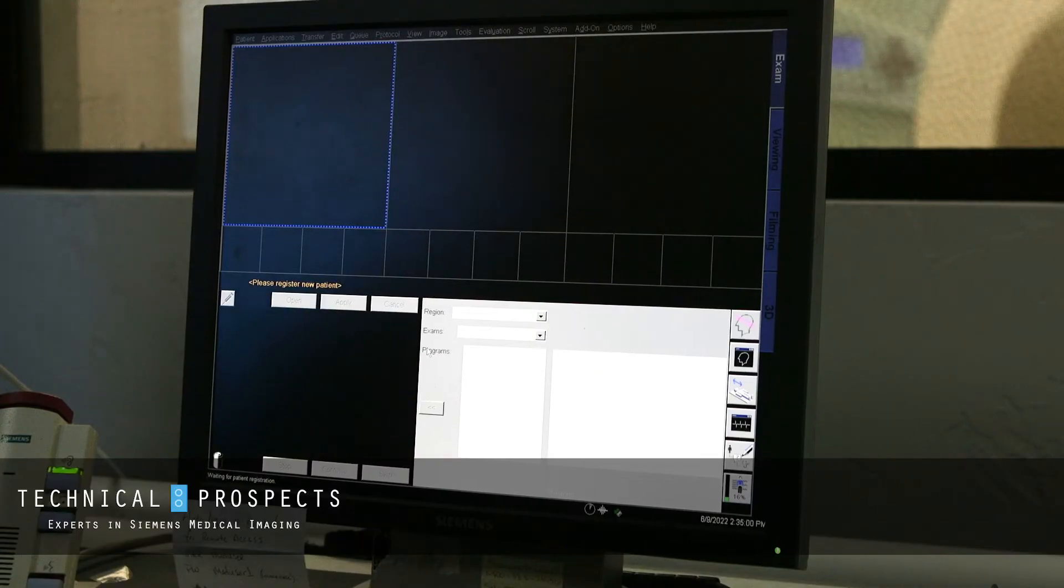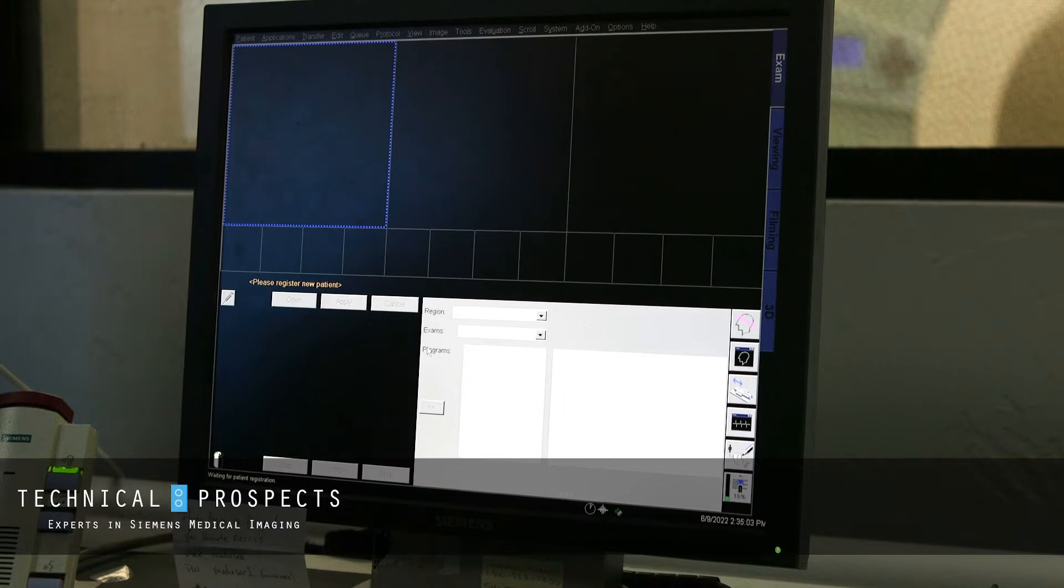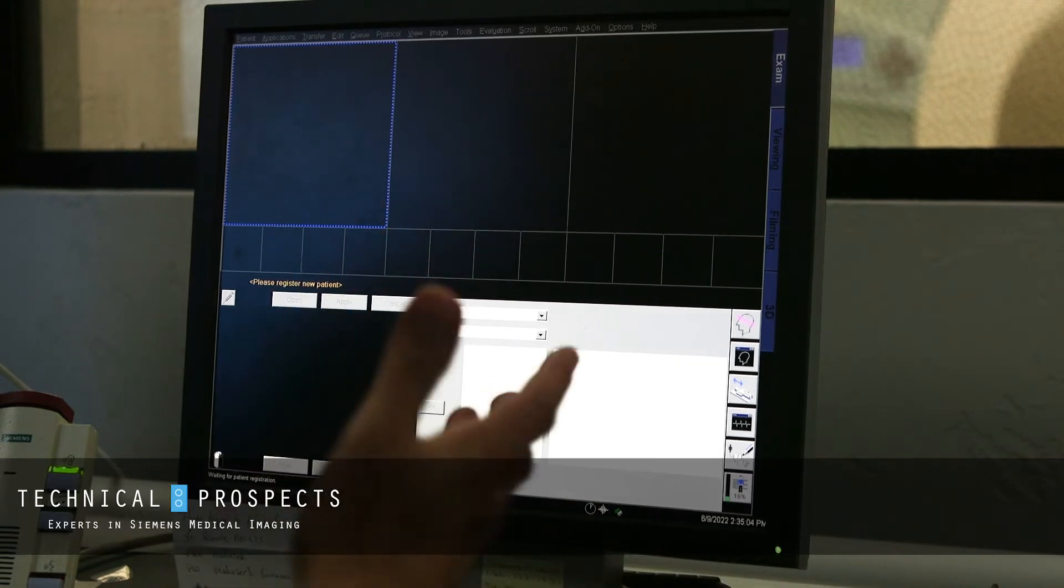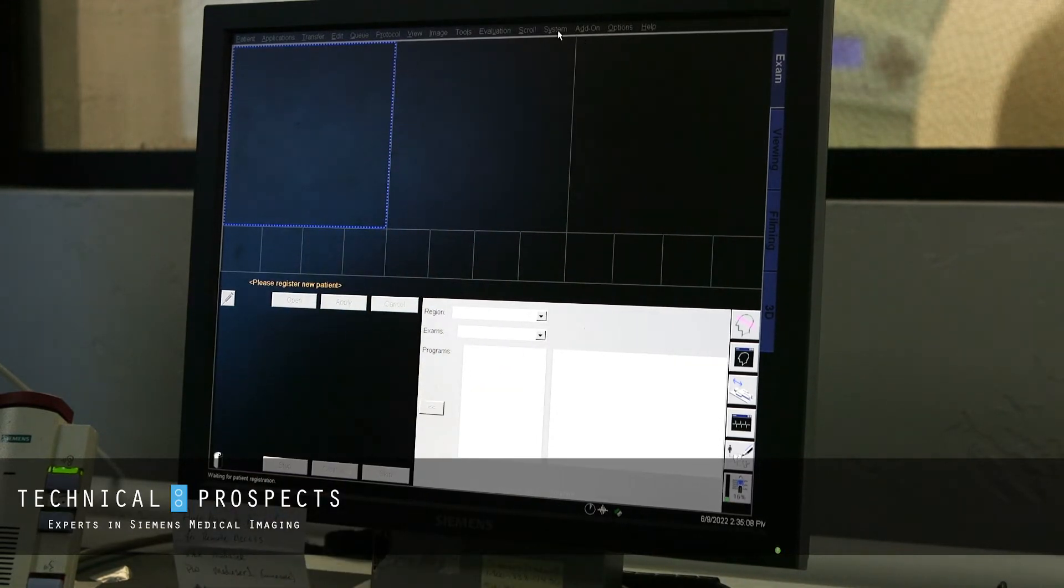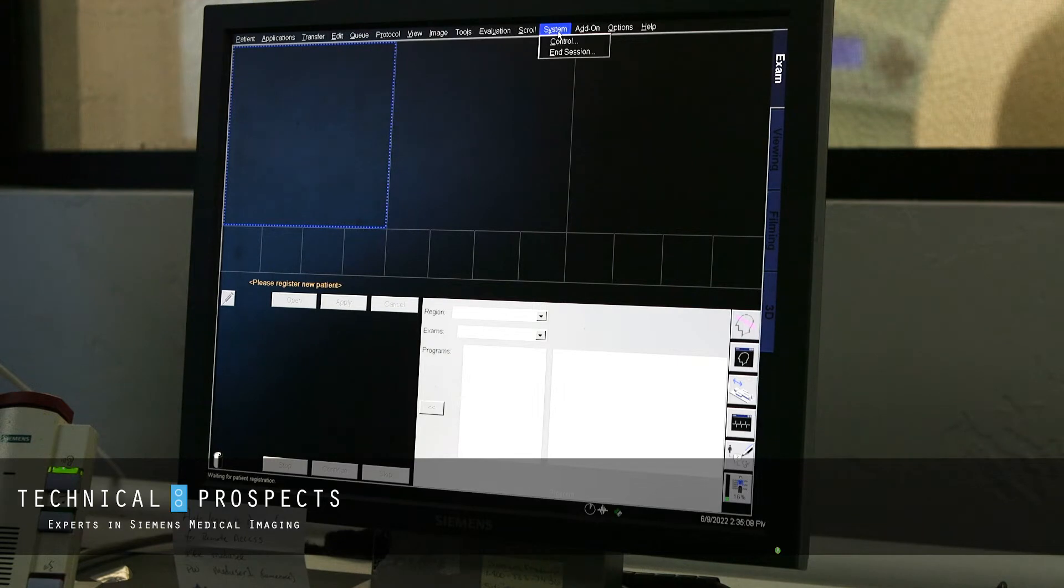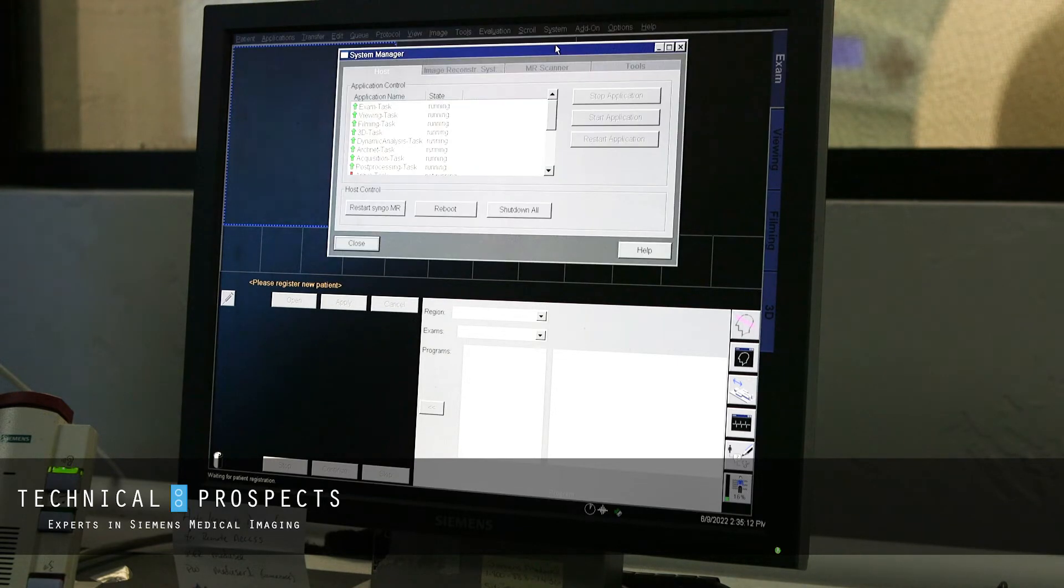So today we're going to show you how to check your helium level on a Siemens Esprit magnet. All you have to do is come up to the very top, select system, select control.